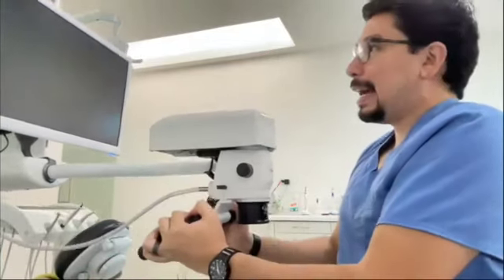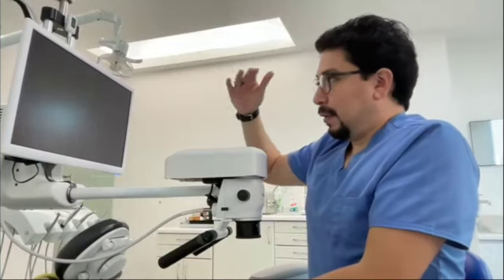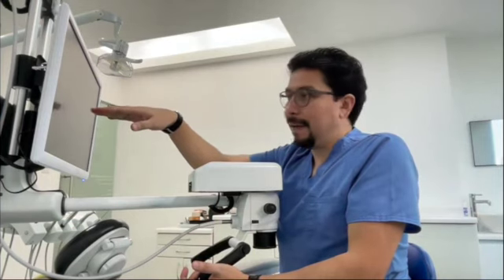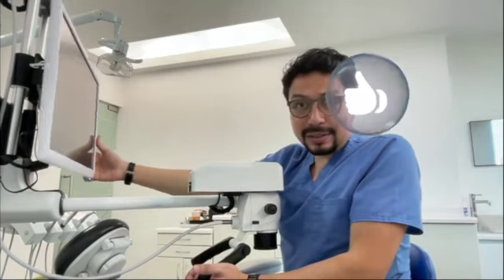Okay? And the screen of the 3D microscope is just in front of me. For example, this is the best angulation and position of the 3D screen for me. I mentioned to you that my vision should hit the center of the screen at a 90-degree angle. But if I need to change the vertical angulation of the screen, you can change it.